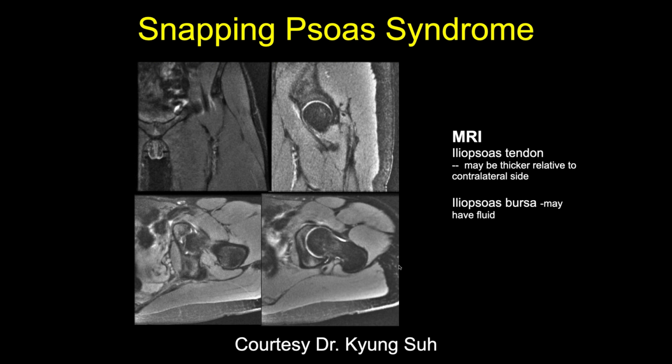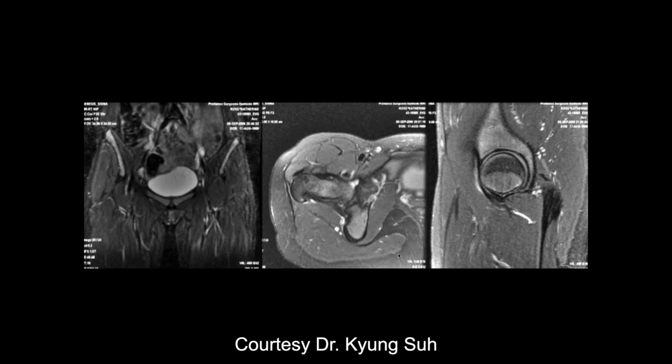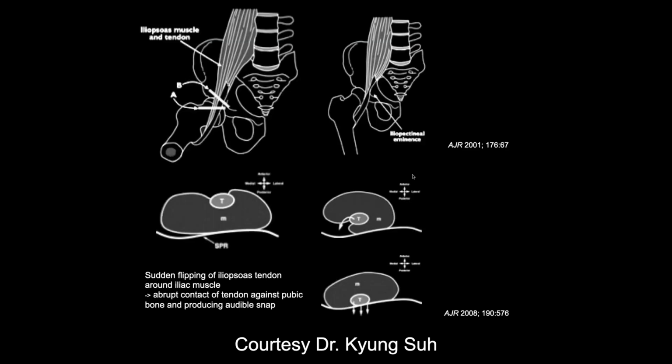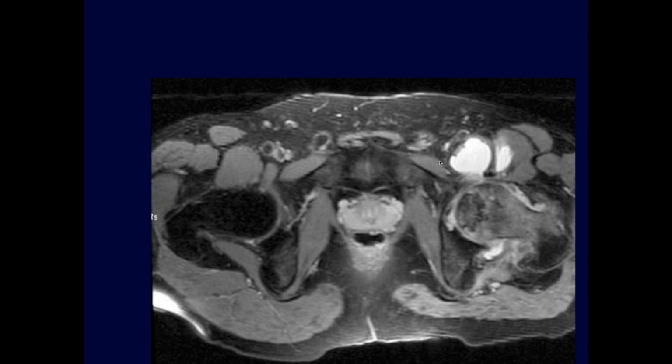Another example. And I think here we can still see the edema around the iliopsoas muscle there, that tendon. And through here as well. And right in here. It just shows where the snapping occurs. When they kick that ball, it's like a pitcher throwing that ball. But probably if you're close by it, it can hurt.